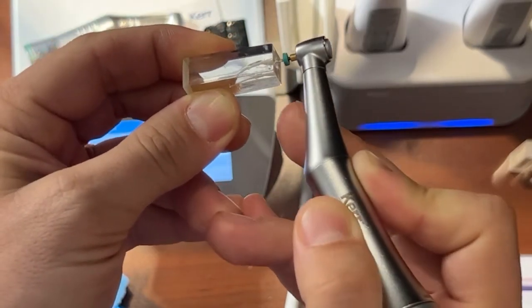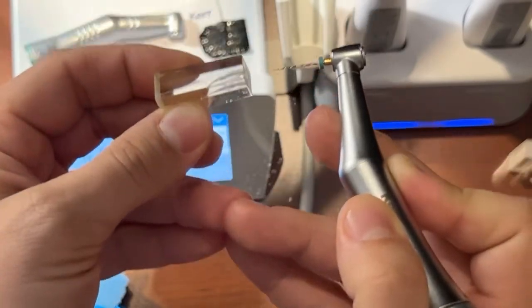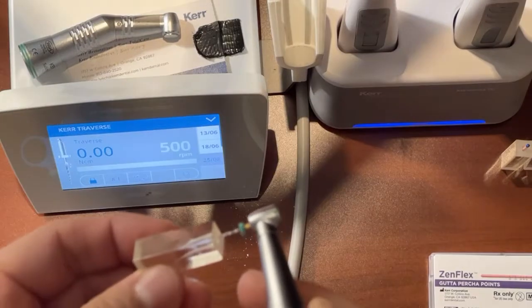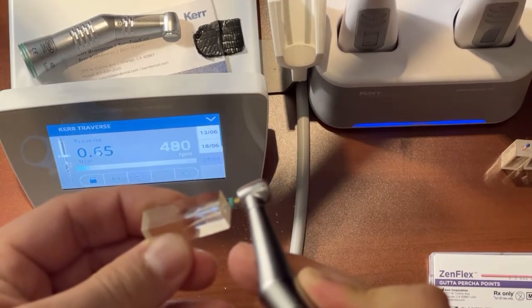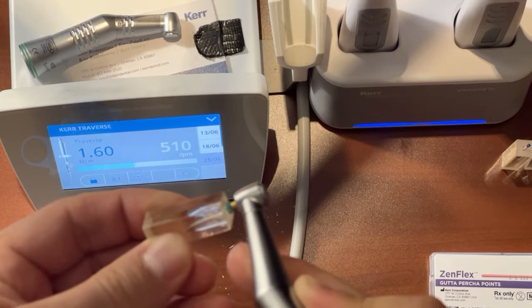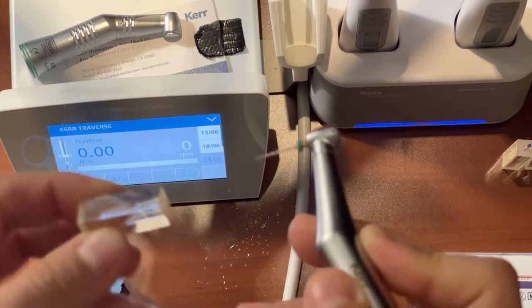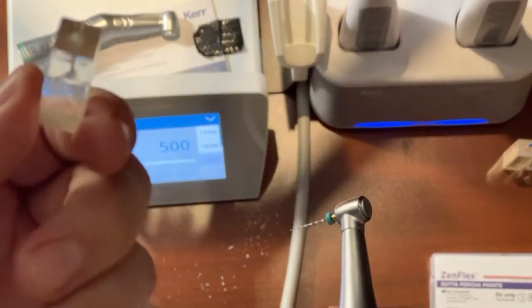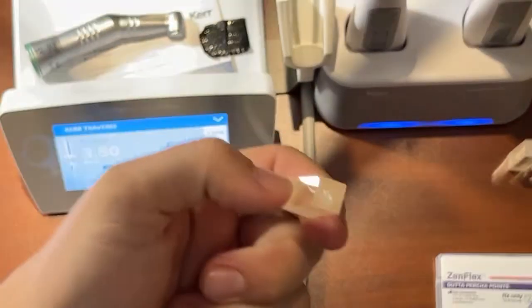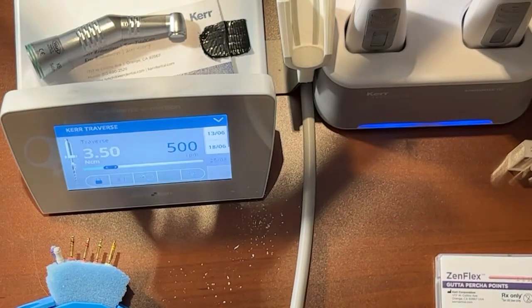Really nice feature too is if you go in a little too hard or fast, it'll do an auto reverse. So it just kicked me out there. There's this little bar if you're looking on the motor, and it's going up and down. You see that blue bar? That's just letting you know how much stress is on the file. So that is our orifice opener. That just opened up that orifice for this root canal.